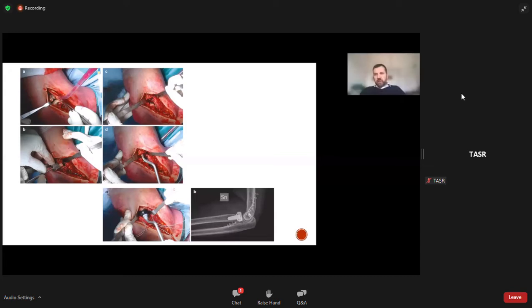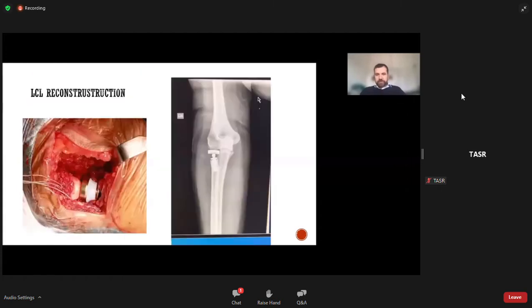The length of the radial head is critical, and you don't want to be implanting a prosthesis and overstuffing. So please refer to bony landmarks in terms of height. You want a prosthesis that is coaxial with the lateral side of the coronoid and not protruding beyond that level. At the same time, in terms of sizing, you want to size it based on bony landmarks. You don't want to size your prosthesis to create a temporary stiffness because the prosthesis is bigger, because that is going to be a painful prosthesis by definition.